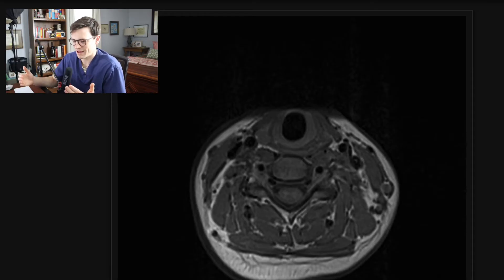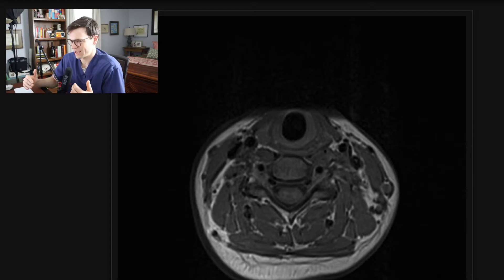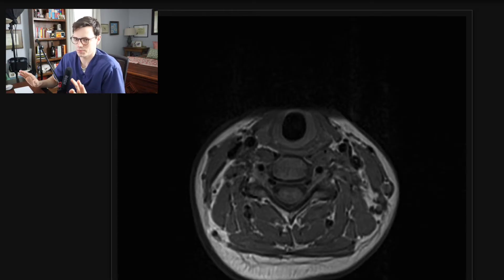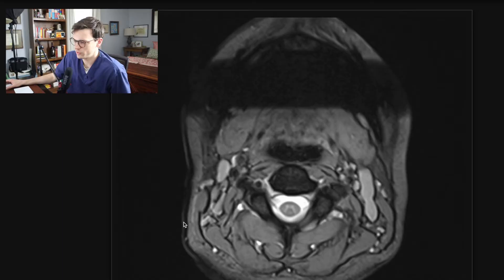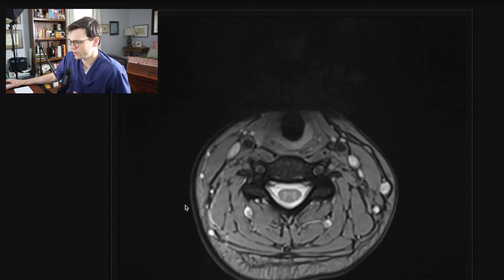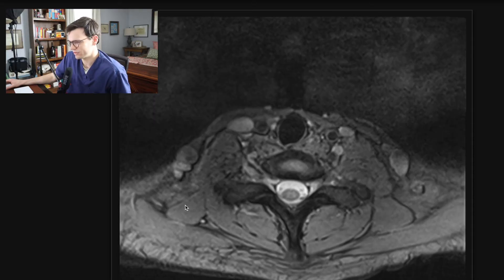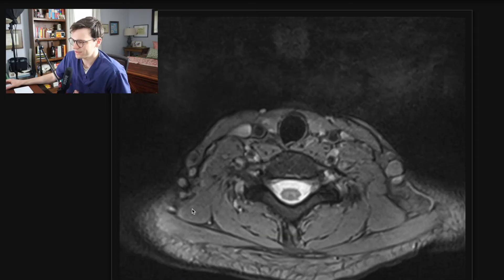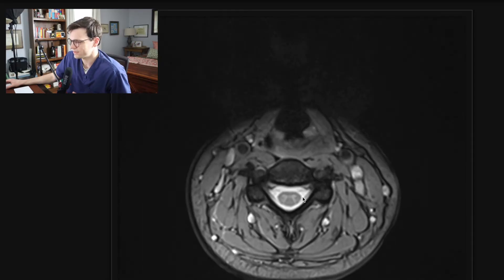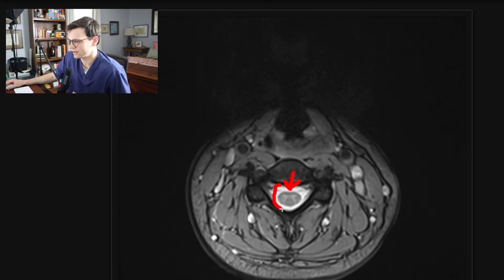I like to use the sagittal and axials next to each other as I'm grading the different levels. I have the axial pulled up here now, and the sagittal alongside it. Starting with the axial T2 weighted sequence, I look at the canal at every single level, scrolling inferiorly. In this case, this is a patent canal with no significant stenosis. Notice the bright CSF that surrounds the cord — the cord is bathed within the CSF. This is a good example of a normal appearance of the canal.